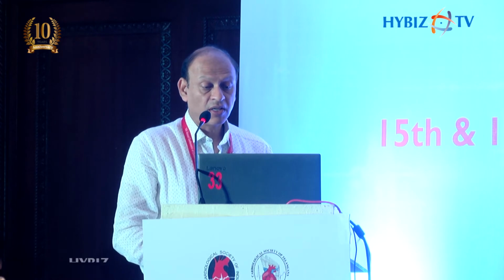A dissection, a plaque prolapse, a protrusion, red thrombus or white thrombus can be differentiated on OCT very clearly. The red thrombus absorbs light and reduces the backscatter. Acute stent malapposition has limited impact on clinical practice, but nevertheless there has been a slightly higher incidence of stent thrombosis in this group of patients. Late stent malapposition can lead to in-stent restenosis. Optimal stent length and dimension assessment is very important. Safe landing zones are equally important when you get good imaging with OCT or IVUS.